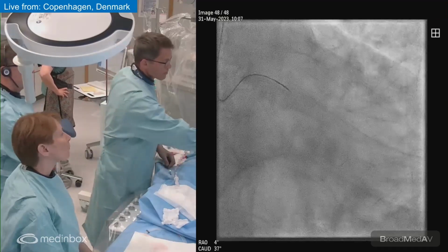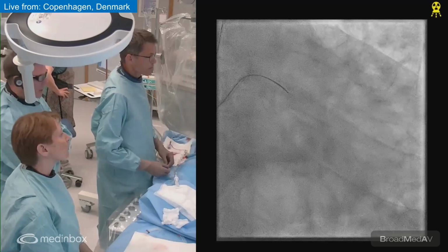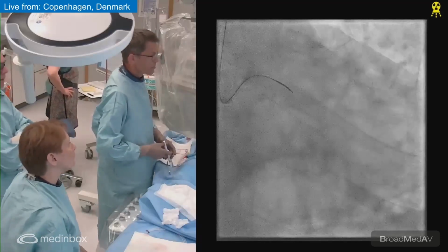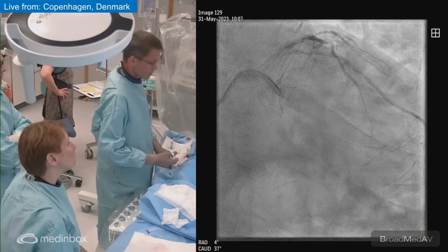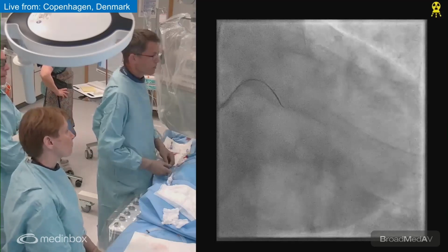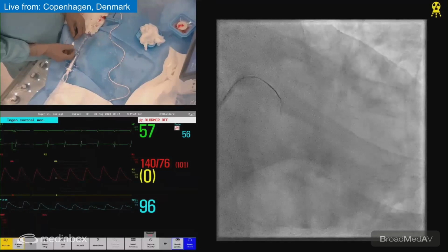And Frans, up to now, he has wired the circuit with just a workhorse wire, and he has a microcatheter, which is a Turnpike Spiral, and then he has a Fielder XTA, and now we're going to see whether we can wire the vessel antegradely. Yeah, you just go ahead, Frans. And the patient is loaded with heparin, and we check the ACT every 20 minutes.